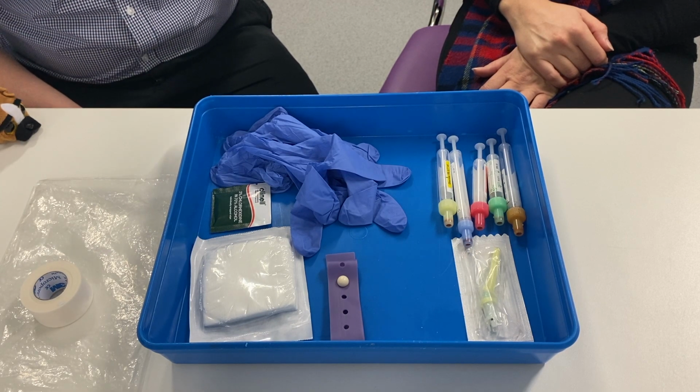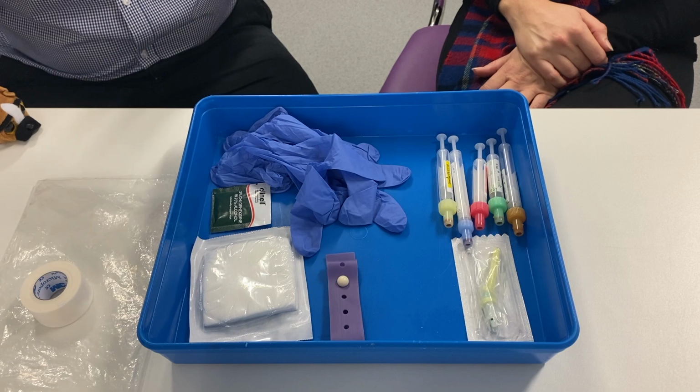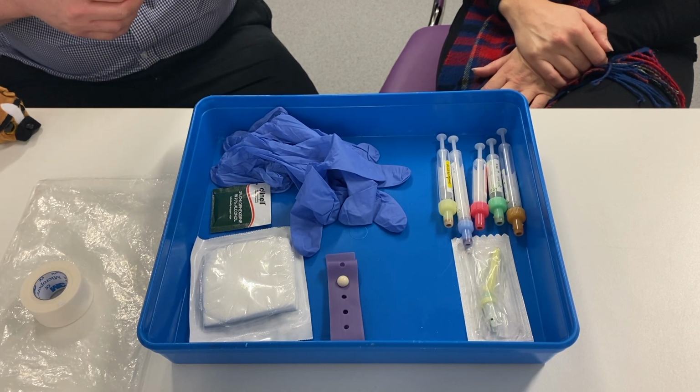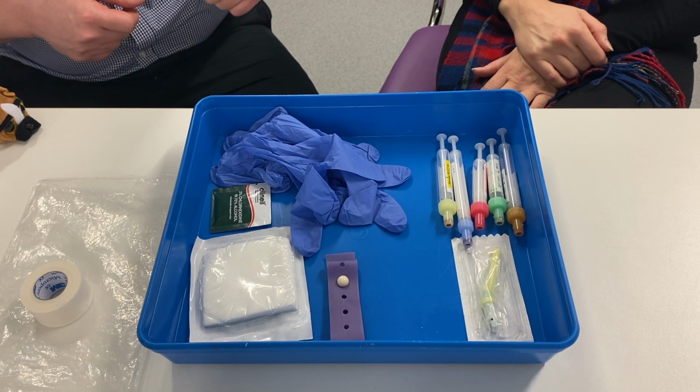But it also is important for the patient so that they don't have to watch you construct this equipment in front of them for this thing that's going to happen to them. So it might make them feel less anxious.